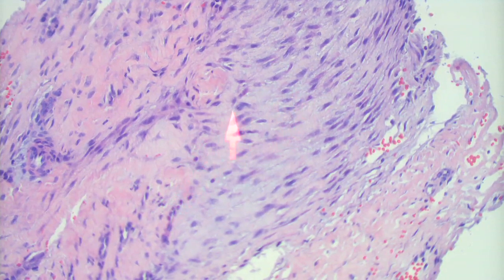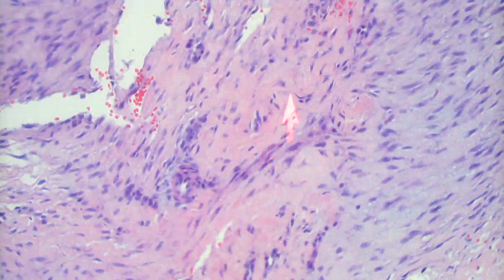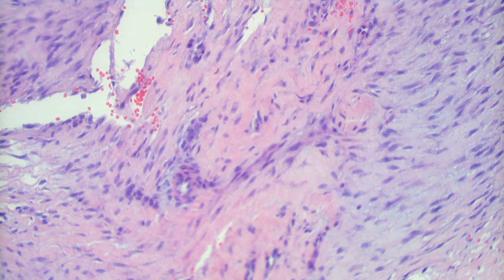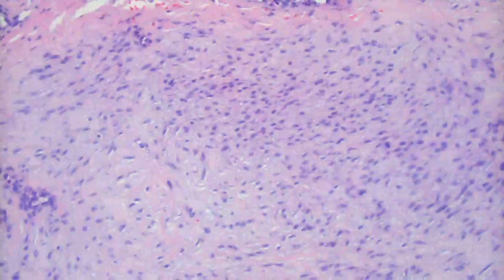These are kind of plump cells. They're not thin, delicate, S-shaped cells like you see with neural. There's also some collagen admixed in here. Pretty thick, ropey collagen down in this area. So yes, fibroblast, maybe some histiocytes, so in that category.